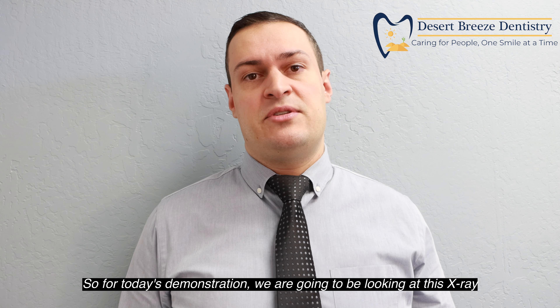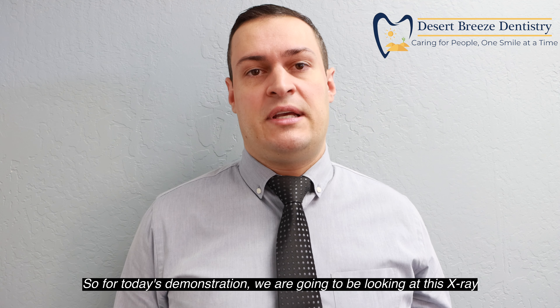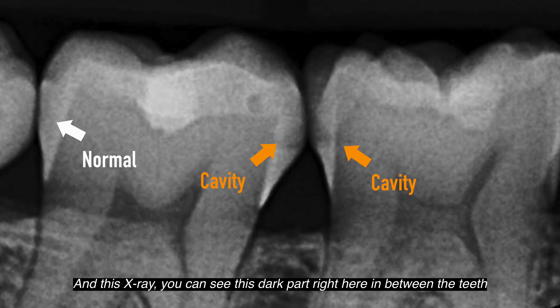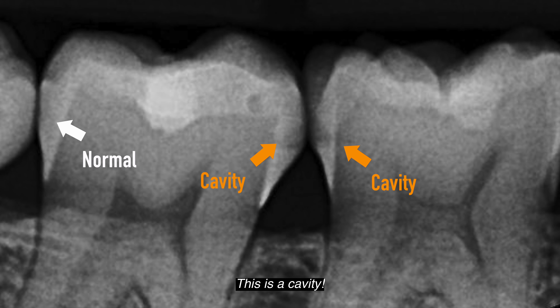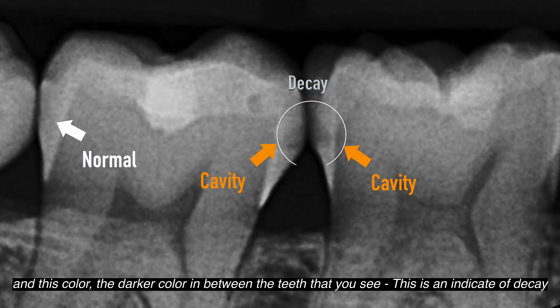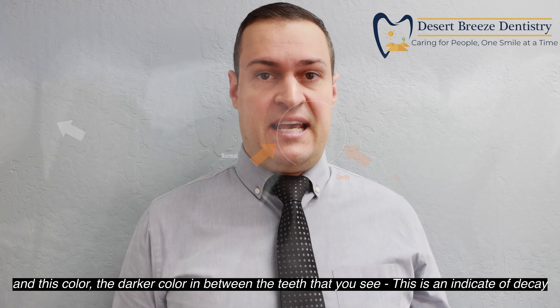For today's demonstration, we are going to be looking at this x-ray. You could see this darker part right here in between the teeth — this is a cavity. The harder part of the tooth shows us the normal colors, and this darker color in between the teeth is indicative of decay.